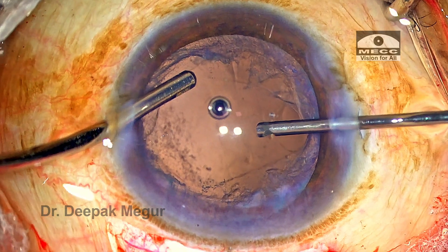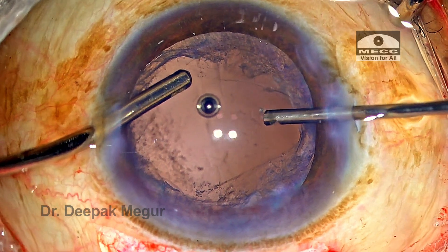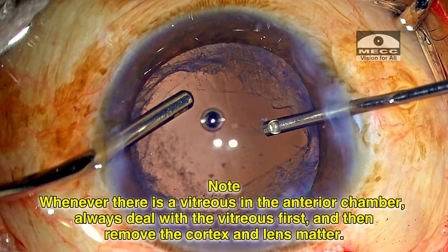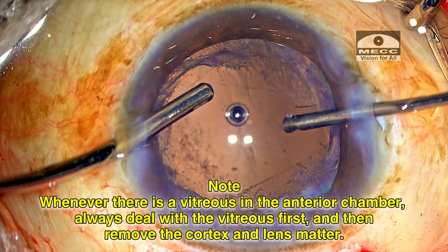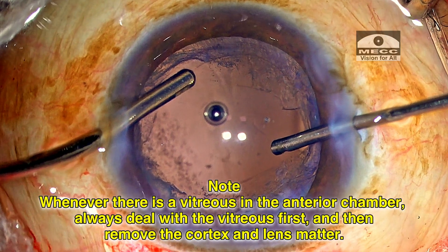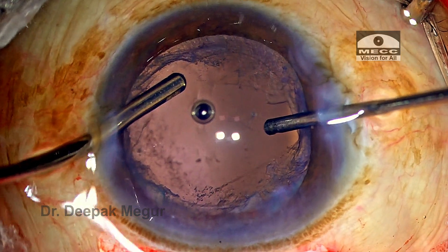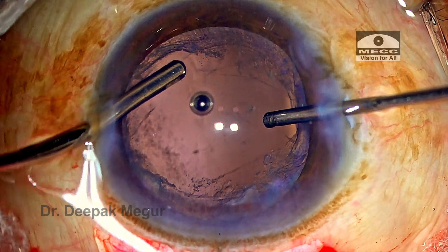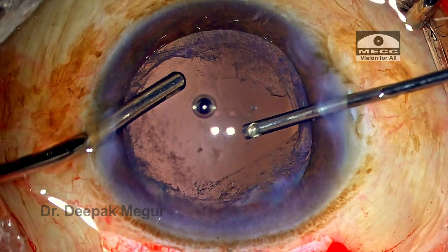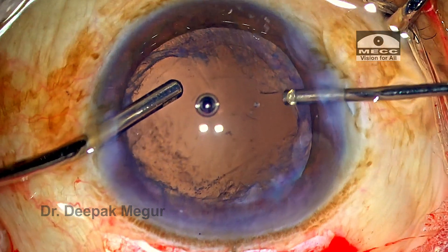By holding the probe steady and proceeding area by area, we minimize the chance of inducing any drag or pull, so that the vitreous base does not experience any traction. Whenever there is vitreous in the anterior chamber, you have to ignore other things like lens matter or cortex — first deal with the prolapsed vitreous, then shift attention to the cortex. Attempting cortex aspiration with vitreous still in the anterior chamber risks pulling and tugging at the vitreous, which can induce traction of the vitreous base and increase the risk of giant retinal tears.